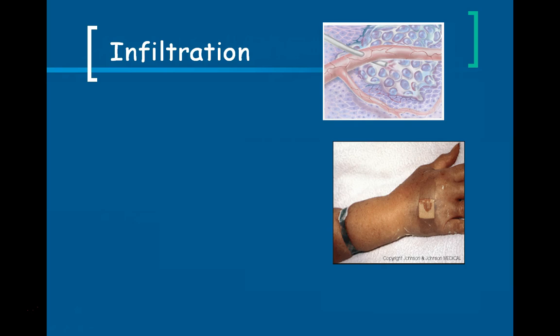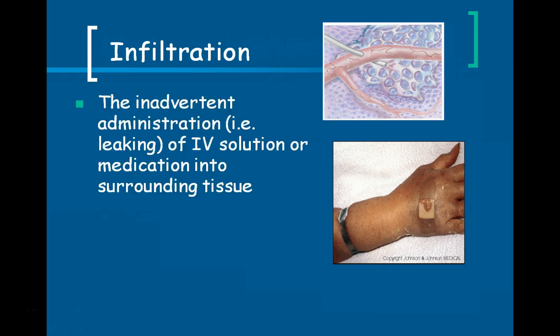So one of the most common complications is infiltration. And infiltration is where the IV solution or IV medication, instead of flowing only into the vein, it flows into the surrounding tissue as well. And that can cause a lot of problems.